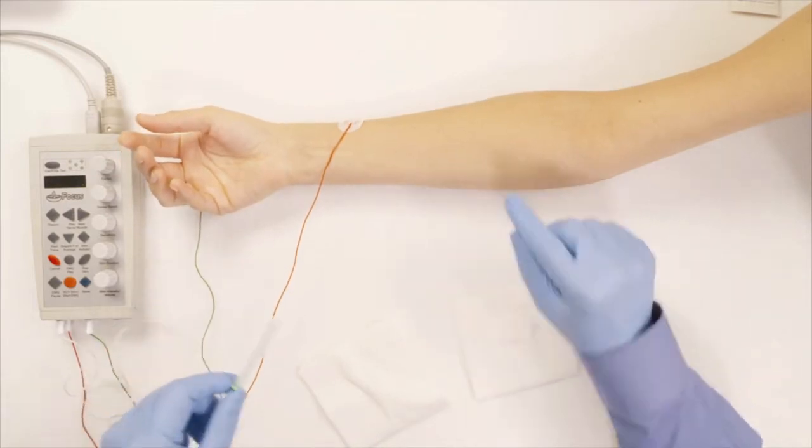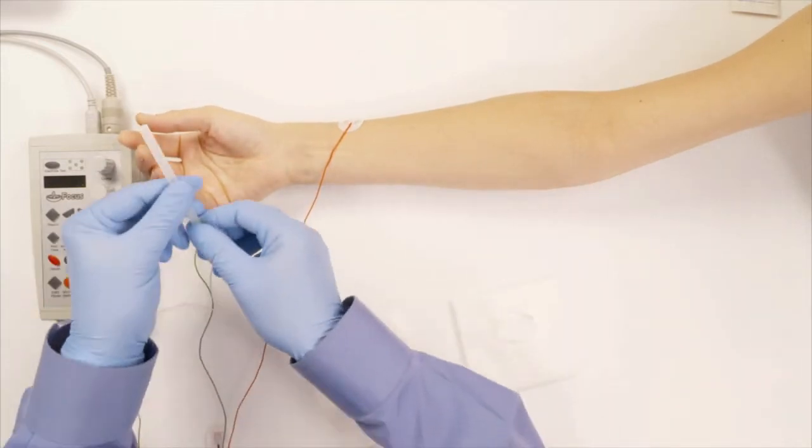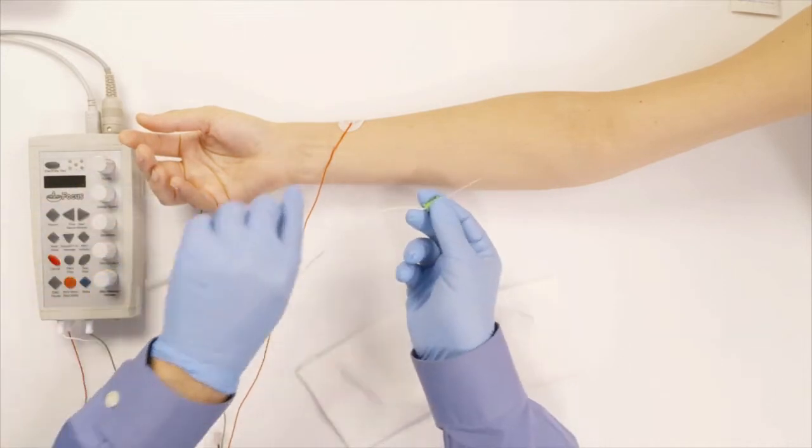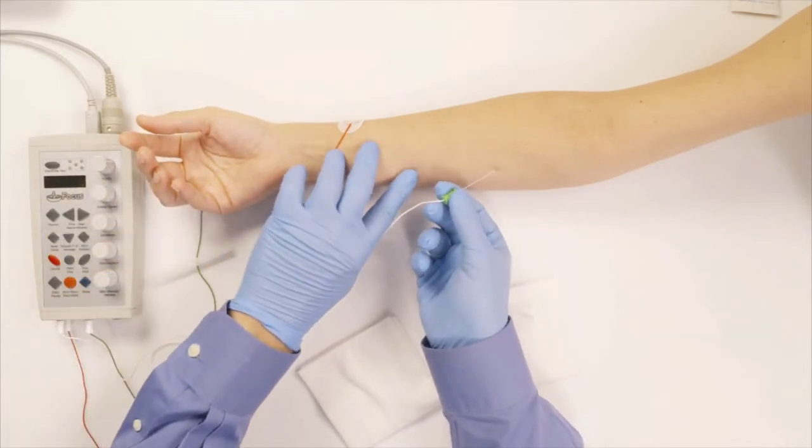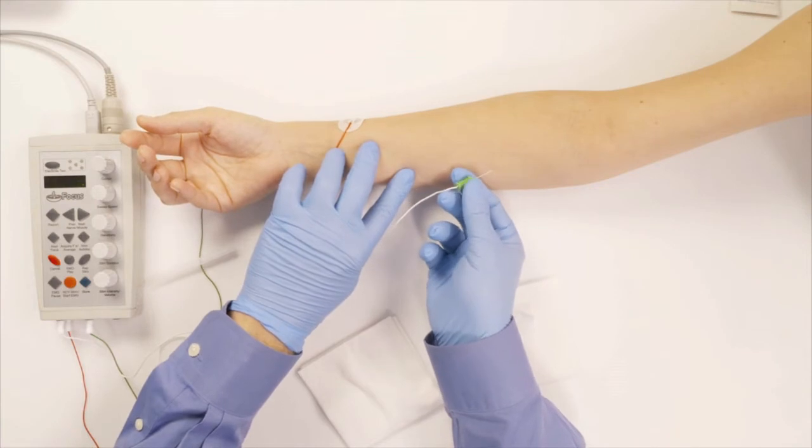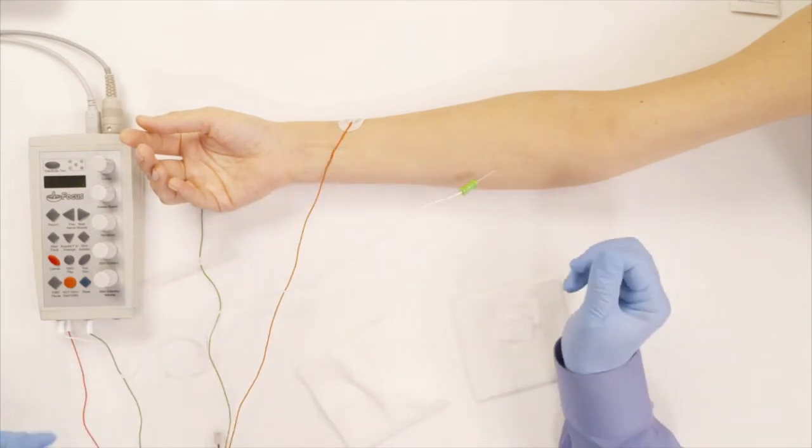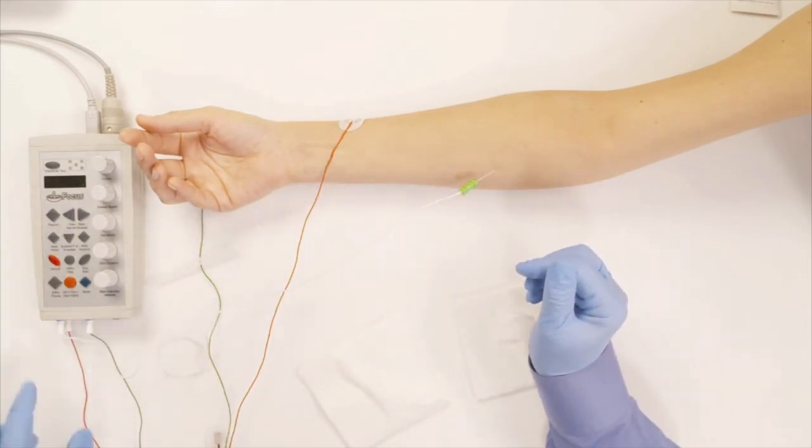I take the needle out here and I stick the needle right here. Here we go, now I'm inside the muscle. And of course to go to the next muscle I press next.